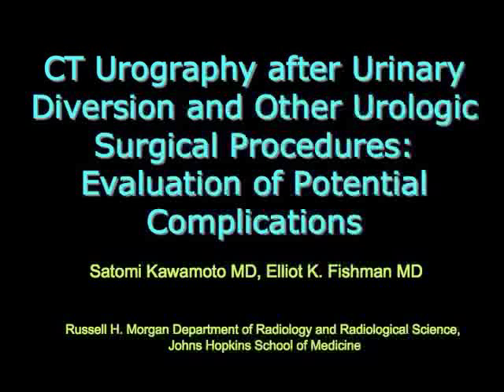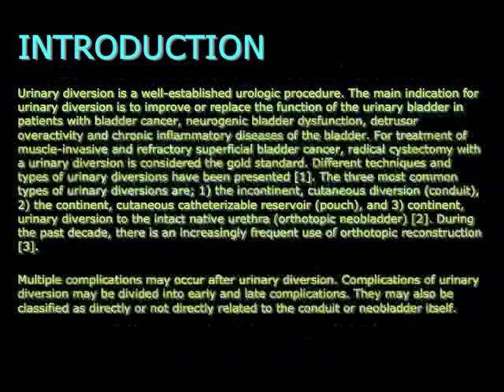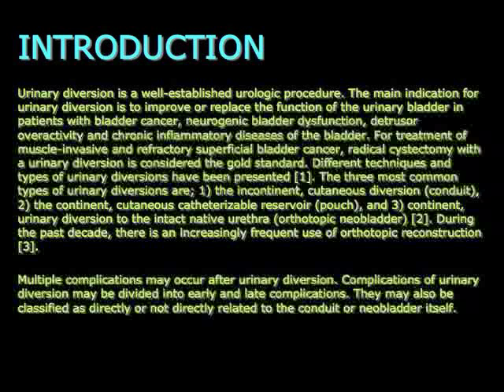A lot of interesting cases, and this is an article that's going to be coming out in Radiographics by Dr. Kawamoto. Now, urinary diversion is a well-established urologic procedure. Its main indication is to improve or replace the function of the urinary bladder in patients with bladder cancer, neurogenic bladder or bladder dysfunction, detrusor overactivity, and in chronic inflammatory diseases of the bladder. For treatment of muscle-invasive and refractory bladder cancers, cystectomy with a urinary diversion is considered the gold standard.